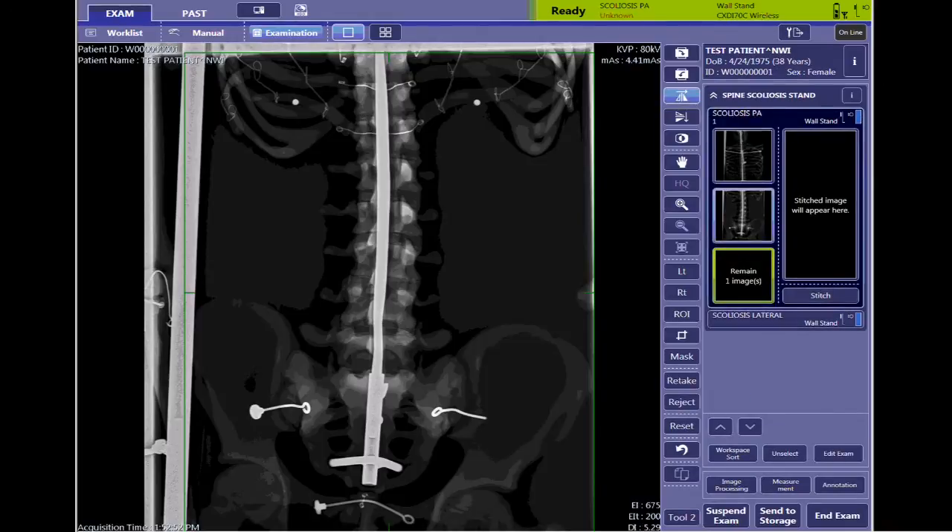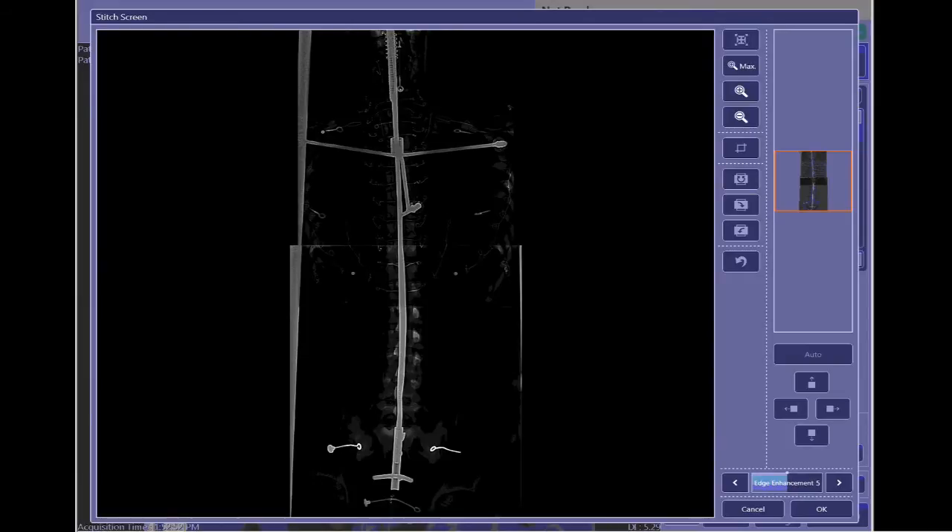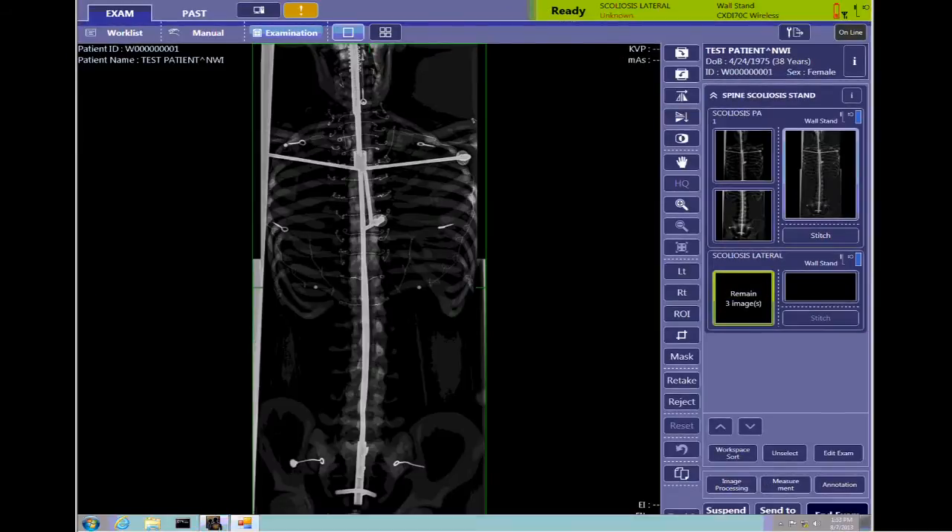Now I've got my cropping where I want. I'm going to click Stitch here. The program opens the Stitch page and stitches my images. I did not get any error messages, so I'm going to click the OK button in the lower right, and it shows me my final stitch image.